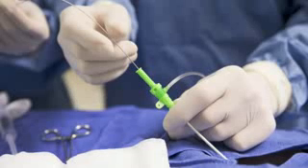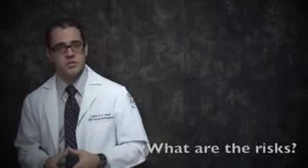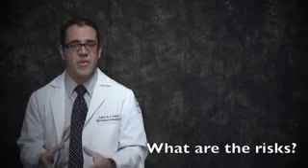A catheterization is done by cardiologists, specialists in the heart, and usually done within the confines of the hospital. You're usually awake during the procedure and it causes little or no pain. However, you may feel some soreness in the blood vessels where the catheter was inserted. Let's talk about the risks of the cardiac catheterization. This procedure is very common.